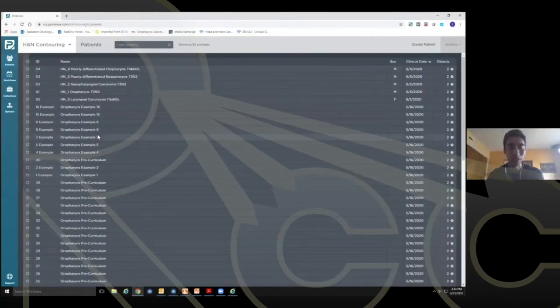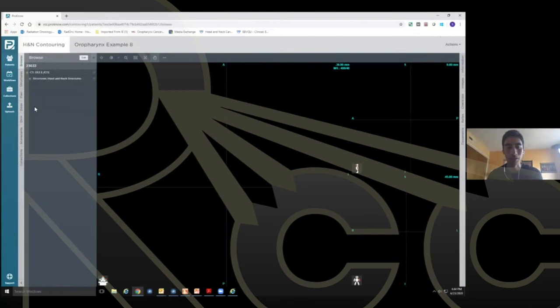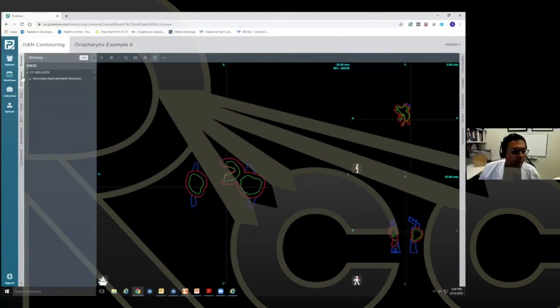Okay. And you see these example ones. So for 8, 15, 18, you should be able to go into those. Oh, excellent. Okay, thank you.